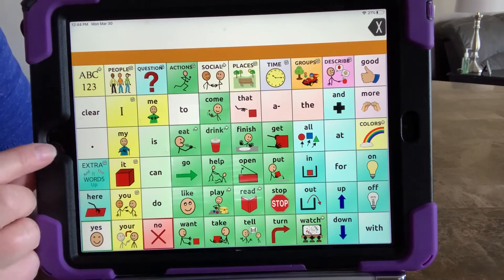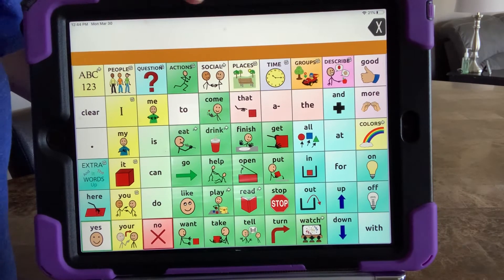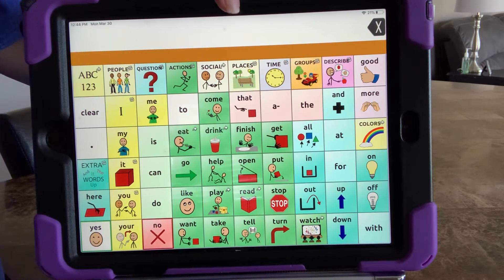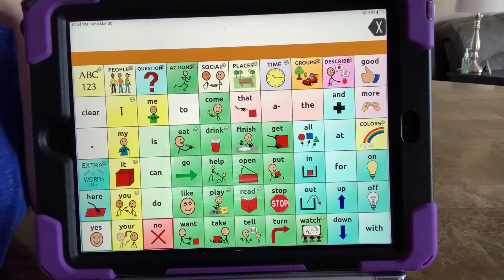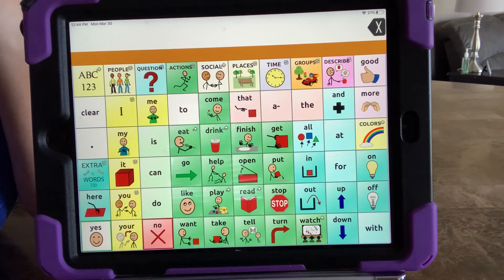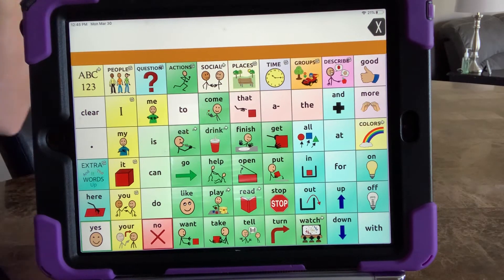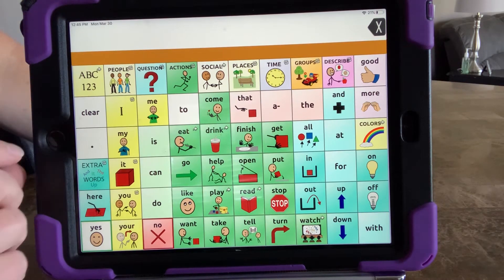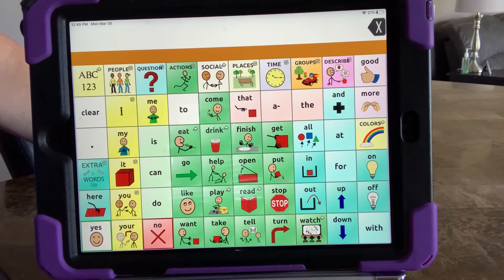If someone tries to keep hitting that home button, this number up at the top will increase and you won't be able to get out. It'll say something like 30 seconds, 60 seconds, 180 seconds before you can try the code again, rather than getting in right away. Just know that's something to be aware of. Right now it is a communication system only.